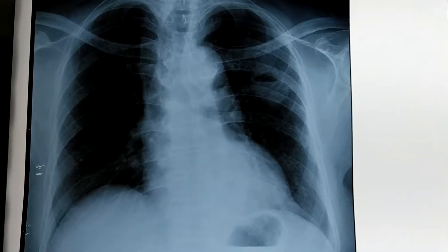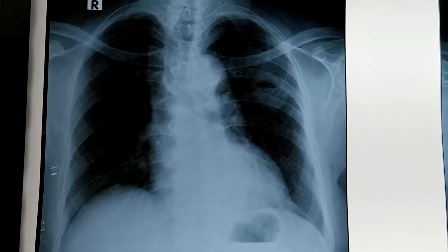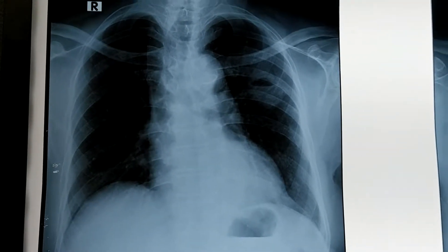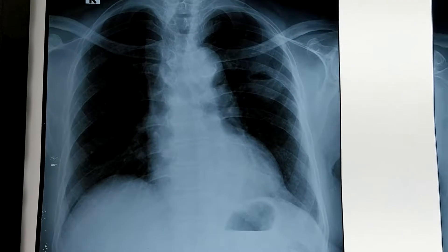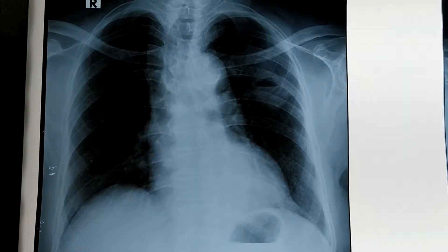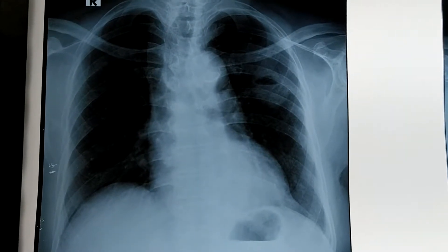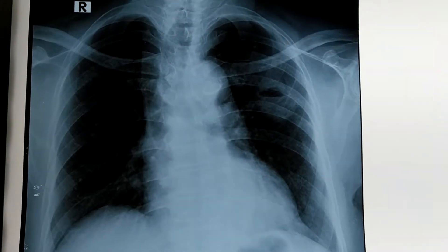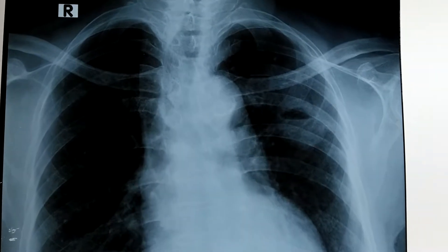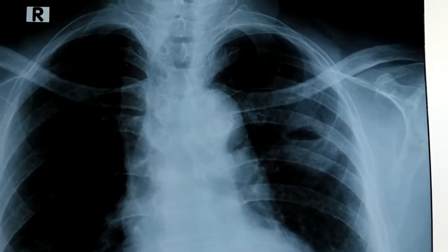Hello, today I am going to present a chest X-ray with very important clinical findings. First, we will look at the chest X-ray from above downwards, very carefully.